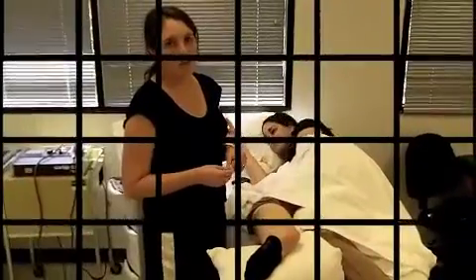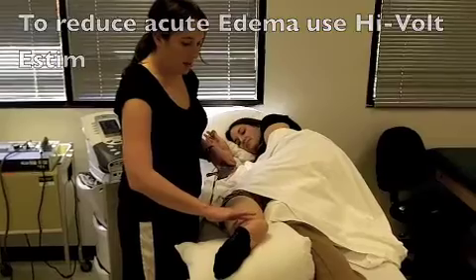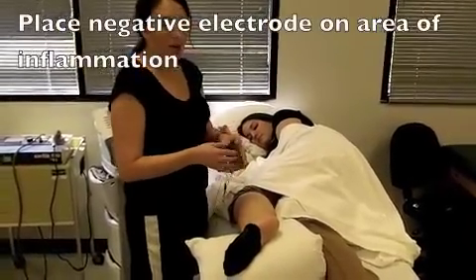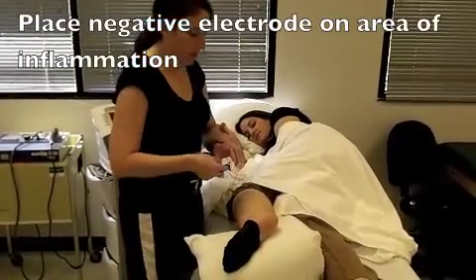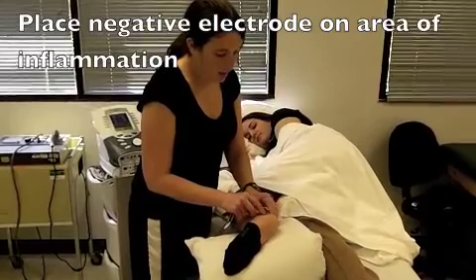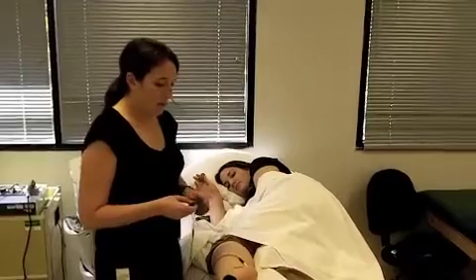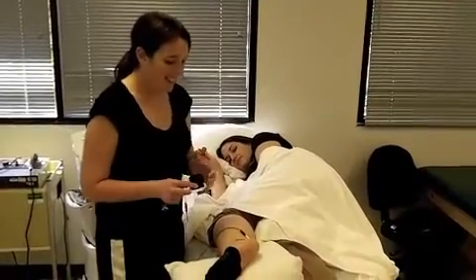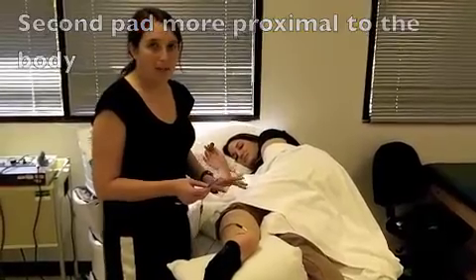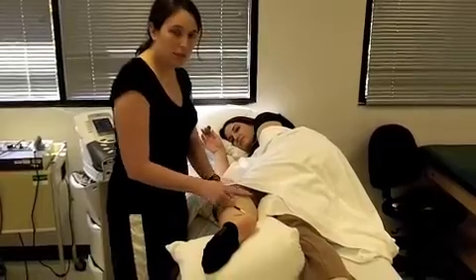For acute inflammation and edema — swelling and inflammation is right here towards the back of the hurt heel — we're going to put the negative electrode pad right there, just behind, sitting on top of the heel. And lateral to the lateral malleolus — posterior to the lateral malleolus. We're going to put the next pad more proximal to our body, about the peroneus longus, which is running in this direction.